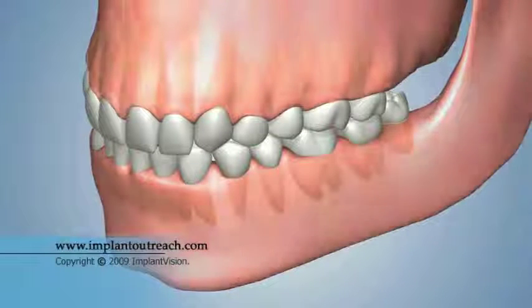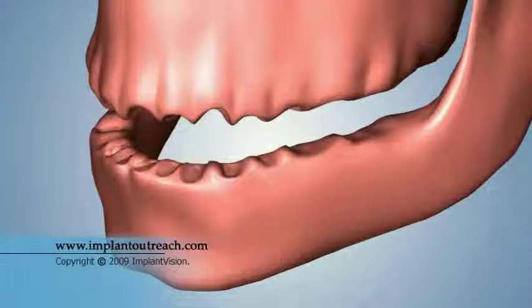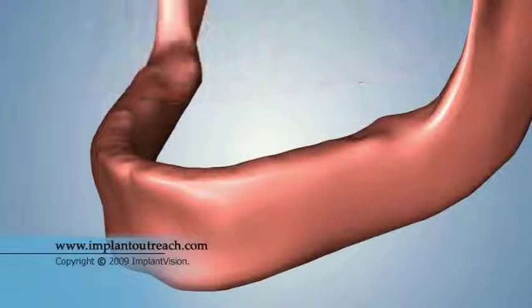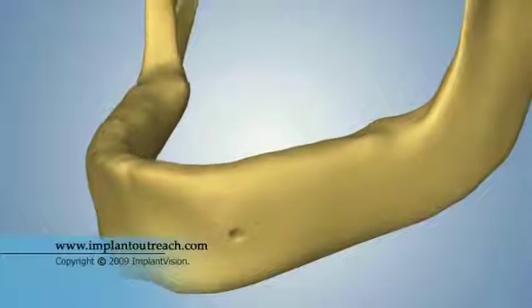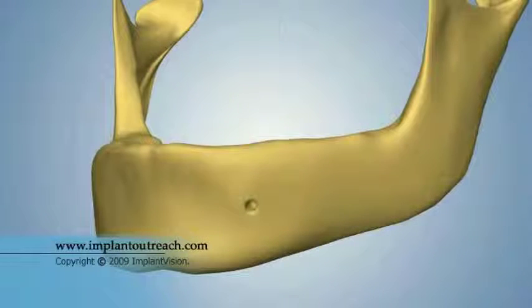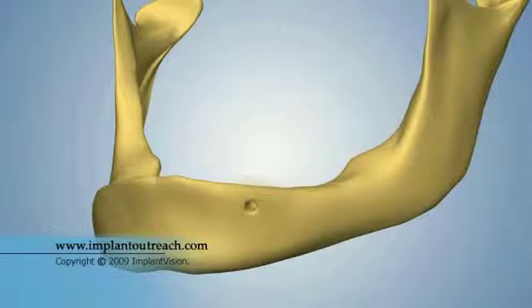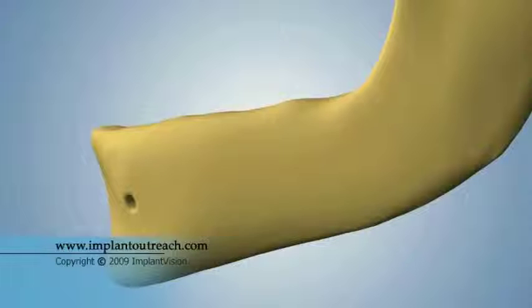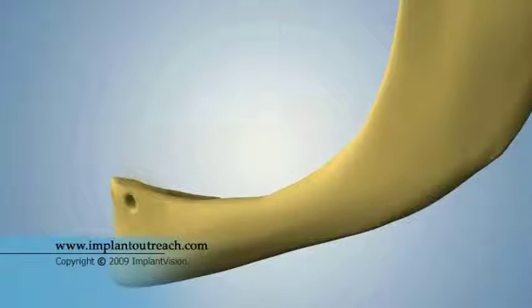Natural teeth are held securely in place by their roots in the jawbone. Disease, decay, or trauma may lead to the loss of all of one's teeth. The roots had previously stimulated the surrounding bone, maintaining the jaw's natural shape. However, with no roots in place, the jawbone will begin to resorb or shrink because it no longer serves the purpose that nature intended.